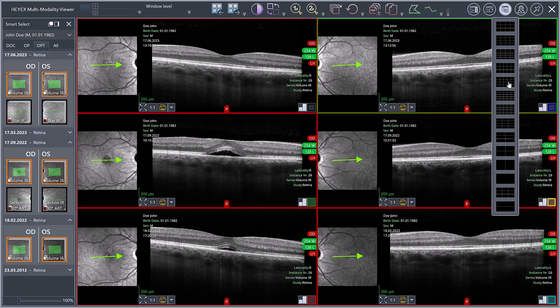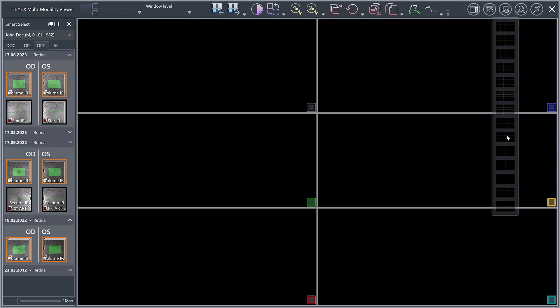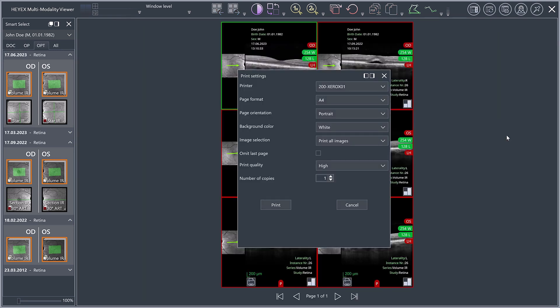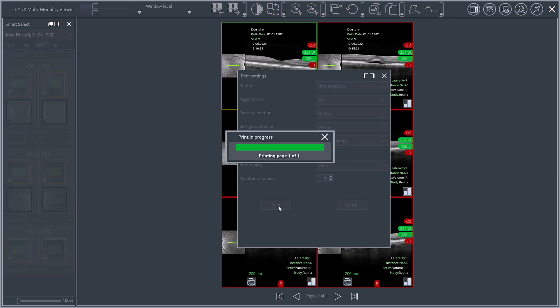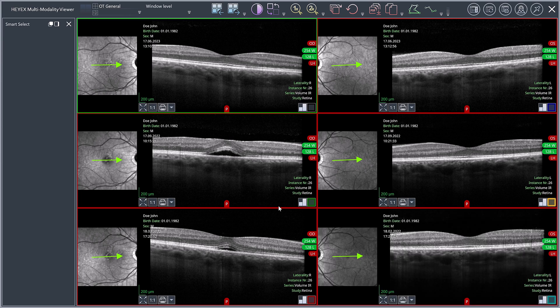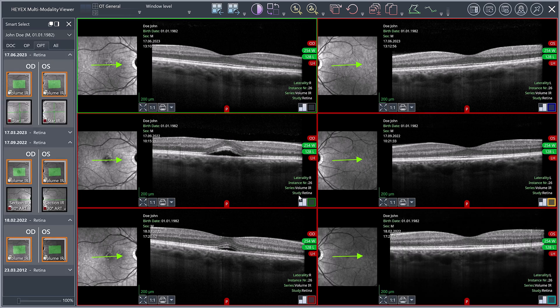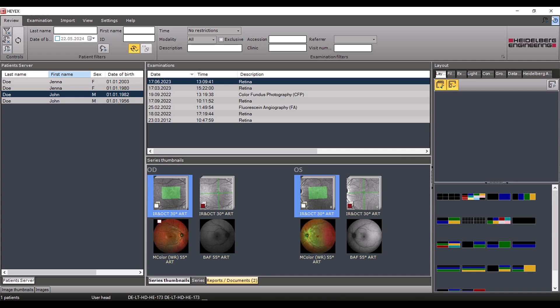In our example, all six images are to be printed. The print preview is displayed. Select the appropriate printer in the print settings and click the print button. Close the window with X to return to the navigator.